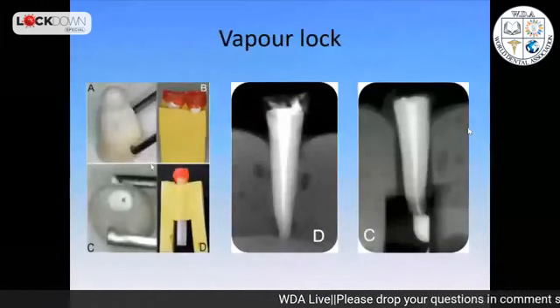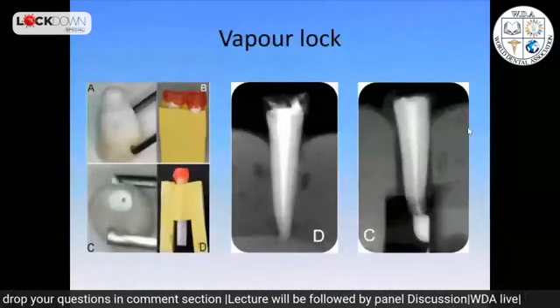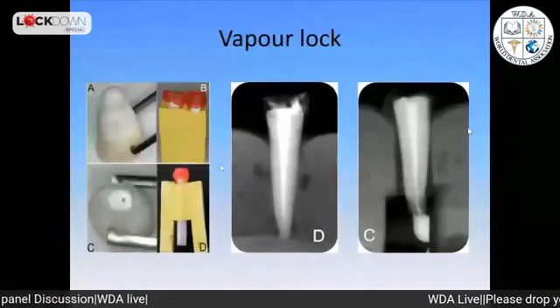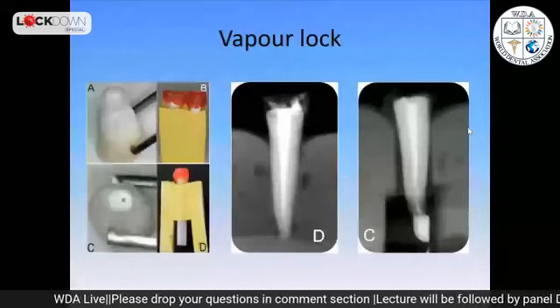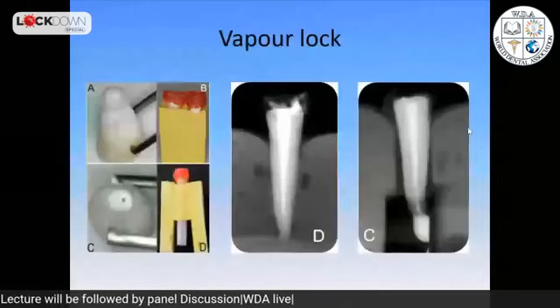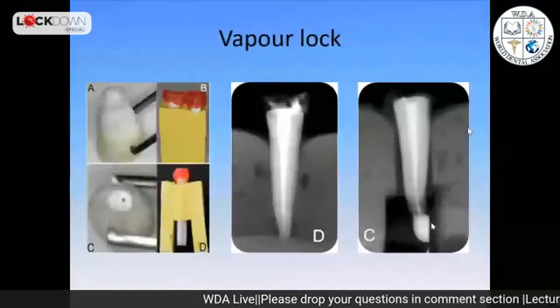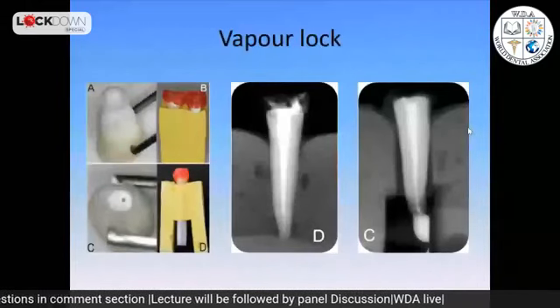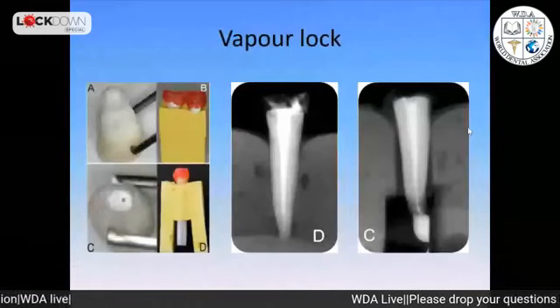This is an experiment from the European University of Madrid. We did something very simple, very obvious now. We had some apices that were sealed and some that were open. Now, image D is a little bit more our clinical reality. If you see, our chemical doesn't really go to the tip, which is where we really need to get. Many of the experiments have been done in a status like C, an open space where chemicals go down. But we have air. We have another pre-existing solution, something else inside the canal. We need to replace it. We need to move away that air.